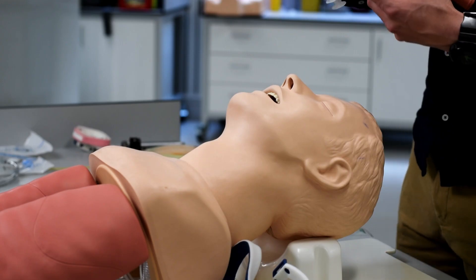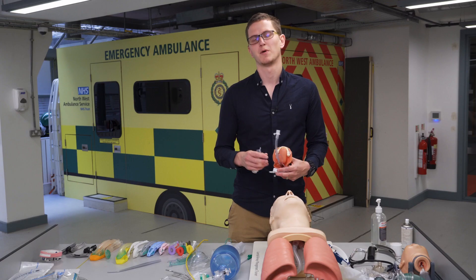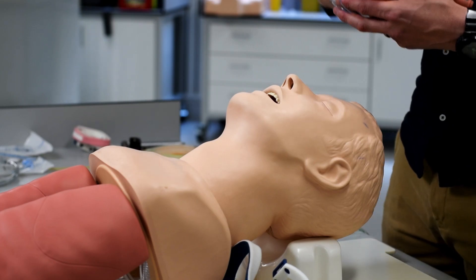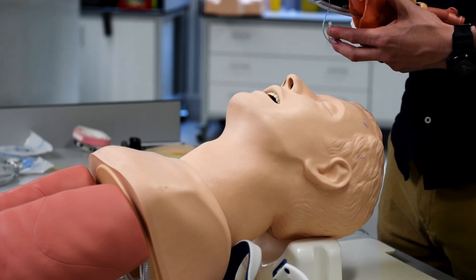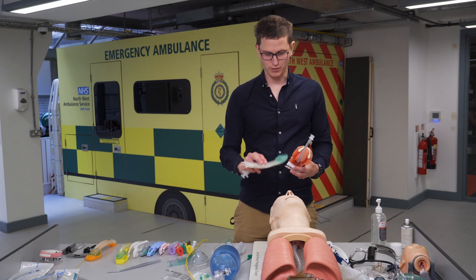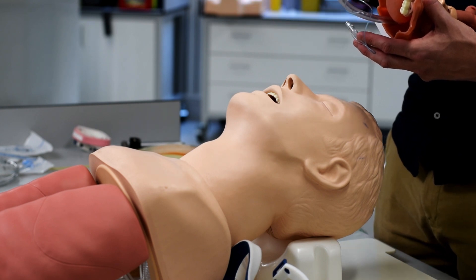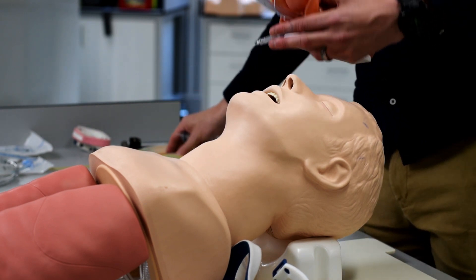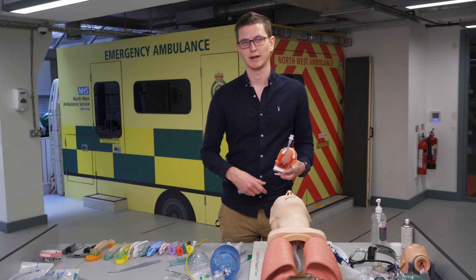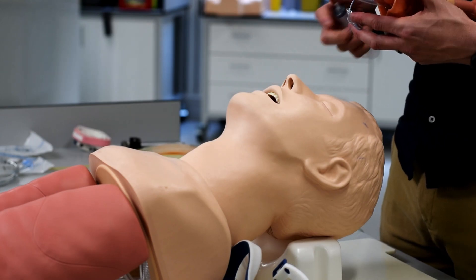The cuff can be inflated slightly and doesn't need much air; a pressure gauge is used to monitor that pressure. The purpose of the cuff is not to stop the tube from moving — it's to stop blood and liquid from getting past and to prevent aspiration. It also allows higher ventilator pressures. An iGel has no cuff, so with high airway pressures it will just leak, and it gives no protection from aspiration.